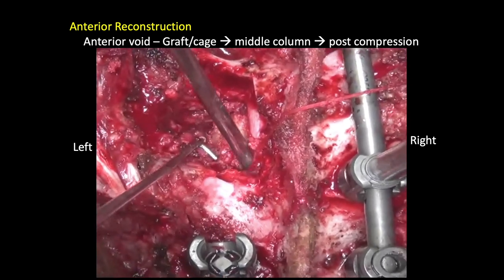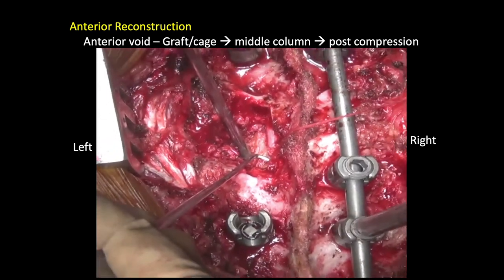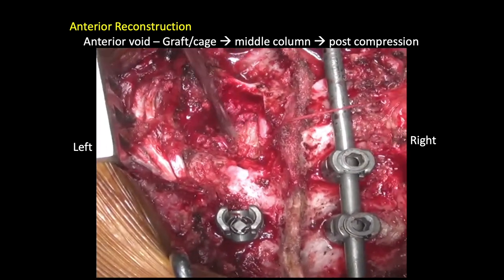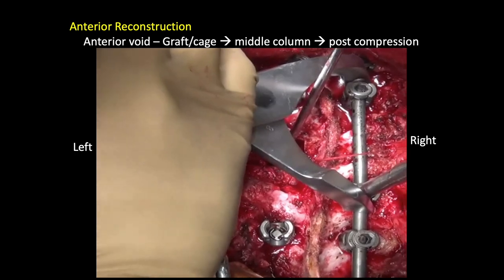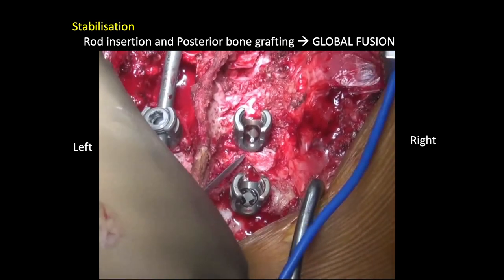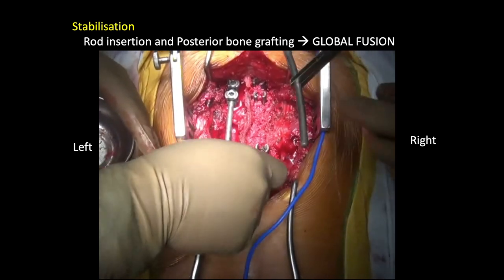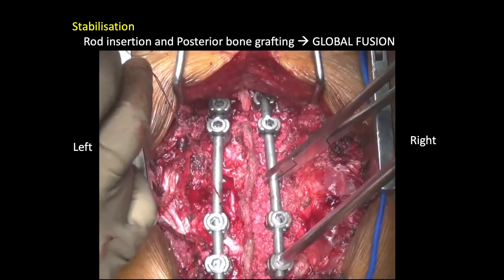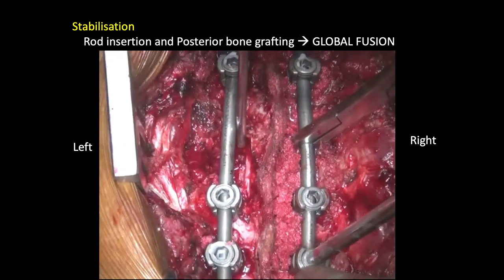An important step here: make sure that the cord is absolutely free. There should be a sufficient space of around 2-4 mm between the graft and the cord, and then you can compress the column from the posterior side, again making sure that the cord is not kinked. Both rods are then rechecked, tightened, and compressed adequately, and the decompression is confirmed along with the reconstruction.